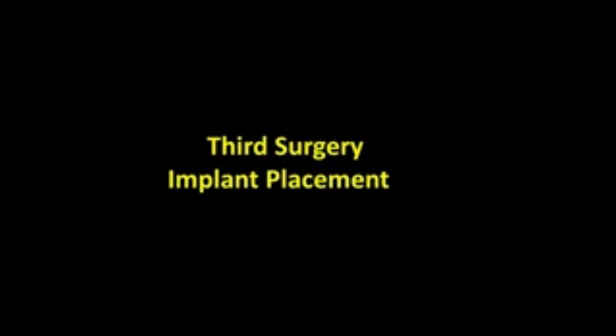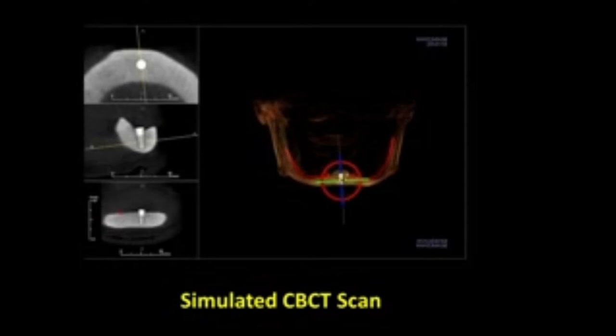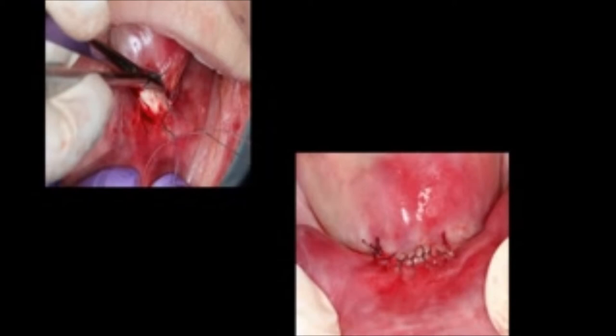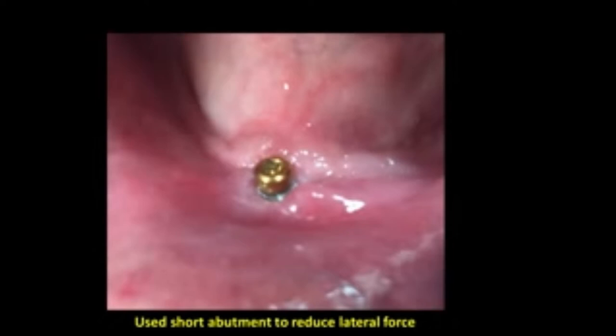The third surgery is going to be the implant placement, which will be fairly routine for those of you who place implants. This is a CBCT scan of the implant we plan to put in — we're going to place an 8mm implant. We're now ready to do the surgery using an envelope flap, and as in the previous keratinized tissue surgery, we're not going to use any vertical incisions. The implant is now being placed, and note that we did not do immediate insertion — there's a reason for this that we'll discuss in a few minutes.